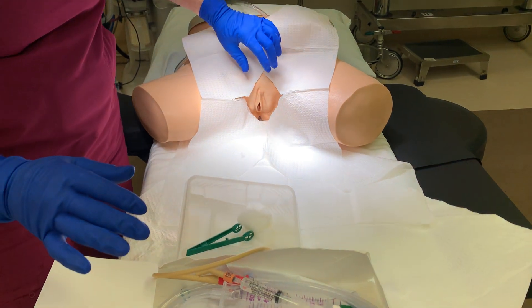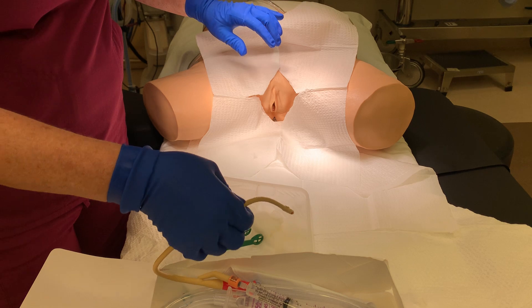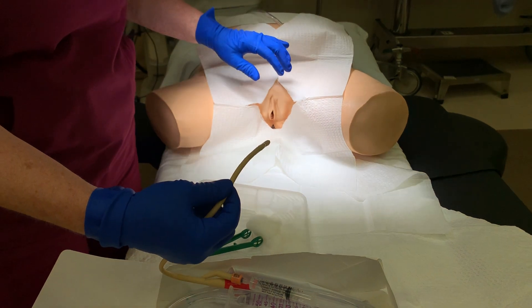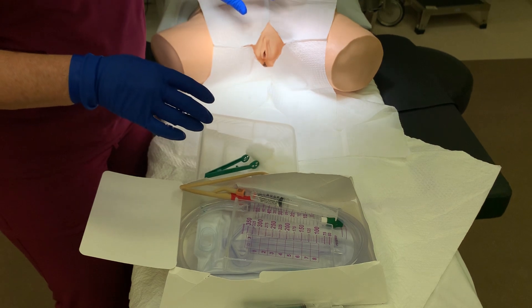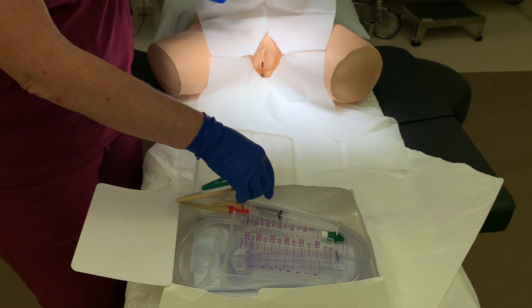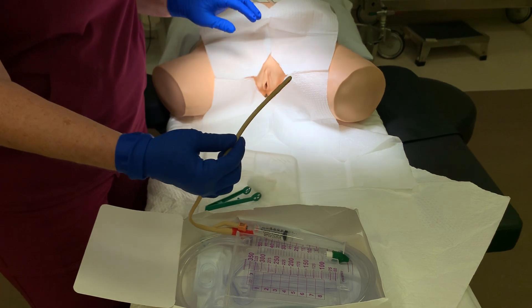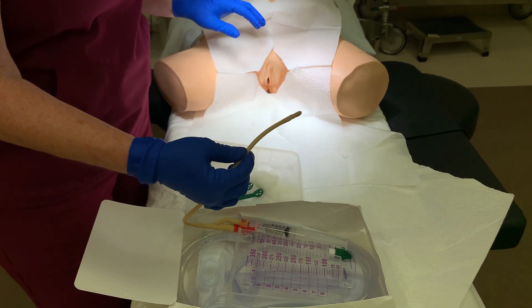On the female patient, the goal is for this catheter to be inserted into the urethra and therefore advanced into the bladder. But females have another opening called the vagina, so you have to make sure that this catheter does not inadvertently go into the vagina. If after you've prepped, this catheter goes into the vagina, you would have to get a whole new kit and start over.